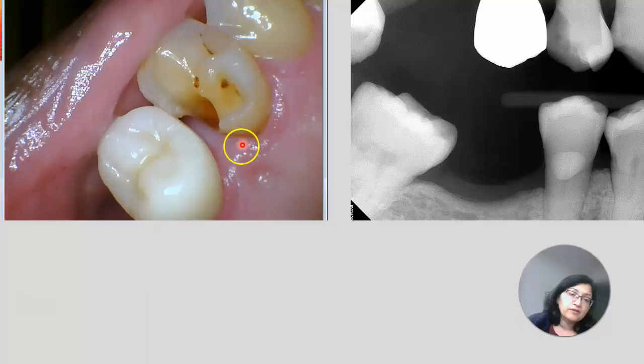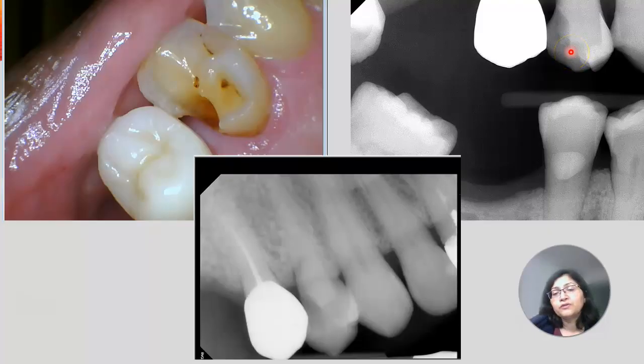But when you see so much gingival inflammation, slight inflammation, and the margin of the tooth is below the fracture line, then how will you decide? Here, in the x-ray, you can see this is not a really great bitewing, but you can see the bone is somewhere here, and this is the margin of the tooth.